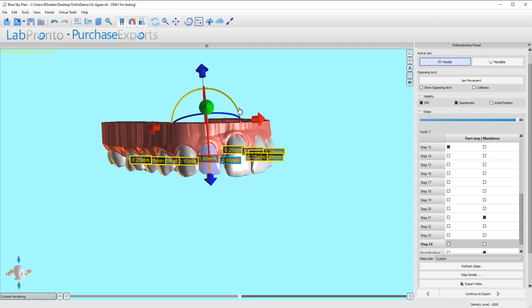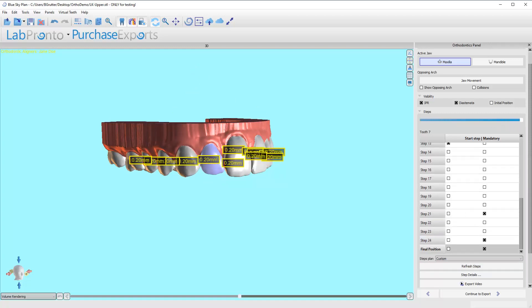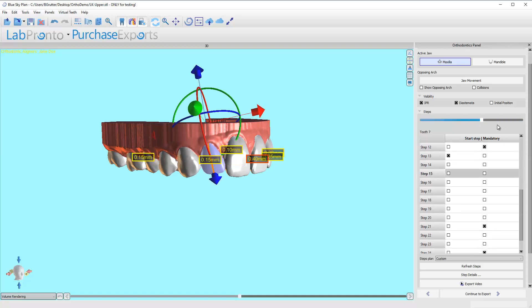If you're having trouble doing these minor adjustments, just keep your mouse button clicked down and bring your mouse farther away from the tooth. That will make it much easier to fine-tune things. Refresh steps — and that looks pretty good to me.